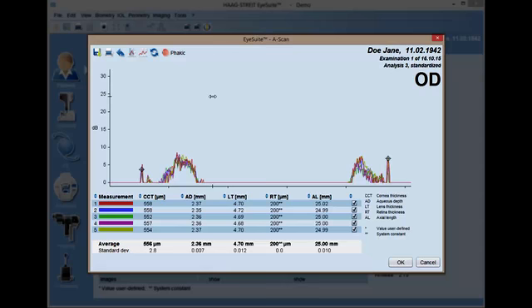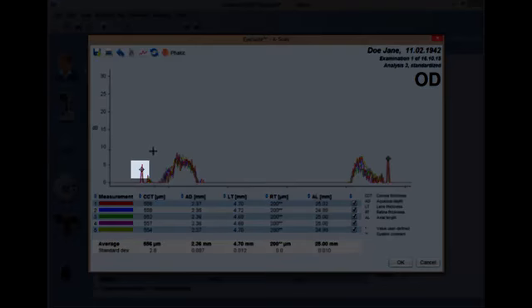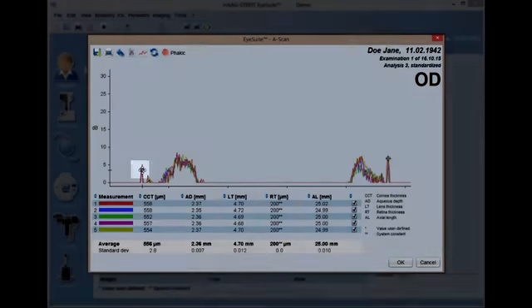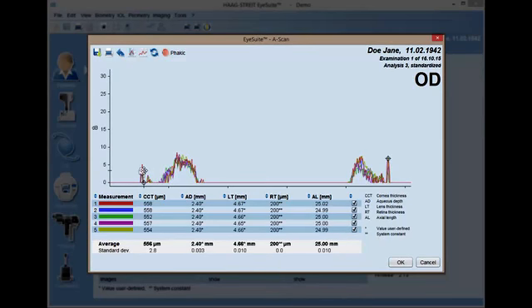After magnification, only the highlighted area will be displayed. To modify the length gates, place the mouse cursor over the gate. This will give the mouse cursor the four-direction arrow appearance. Left click and hold to move the gate to the preferred location. Letting go of the mouse button will reposition the gate.